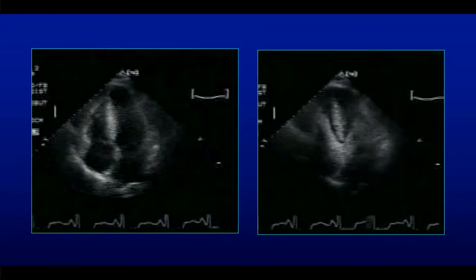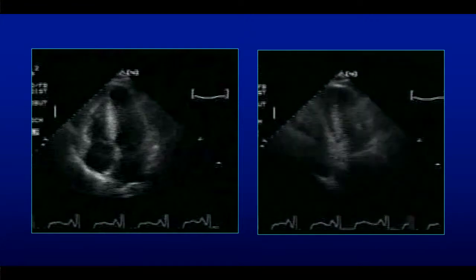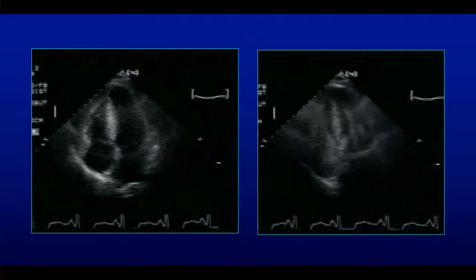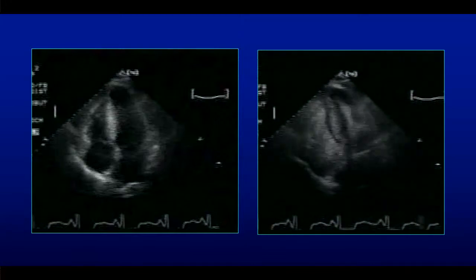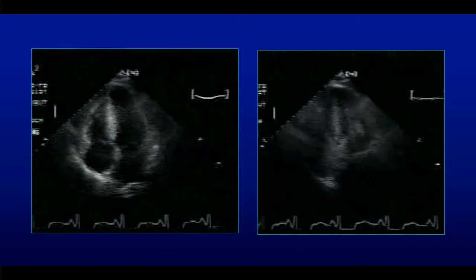You see a hypertrophic cardiomyopathy with a major septum, that we talked about before in previous conferences and talking to our fellows and faculty. Hypertrophy is underestimated, particularly from the apical window, particularly if you're not seeing well. So you gotta be very careful in those situations and use contrast appropriately.